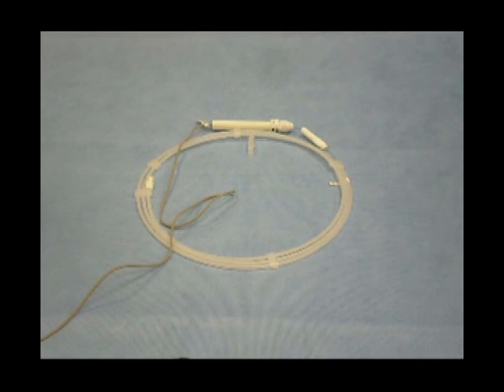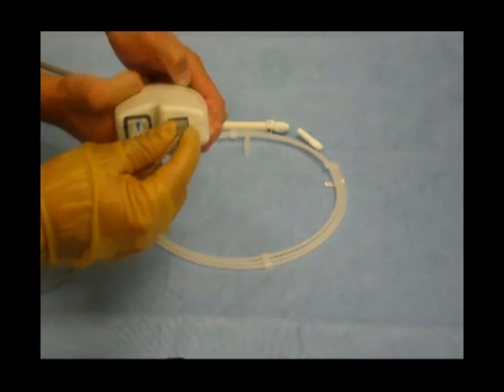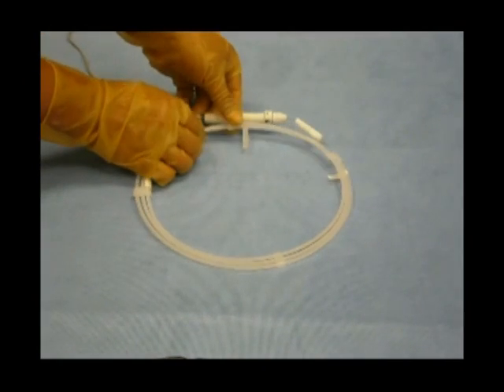This is the pressure wire. Hand off the wire to the scrub tech using sterile technique. Do not flush the wire. Place the hoop with the wire on the patient table and remove the phone jack connector.